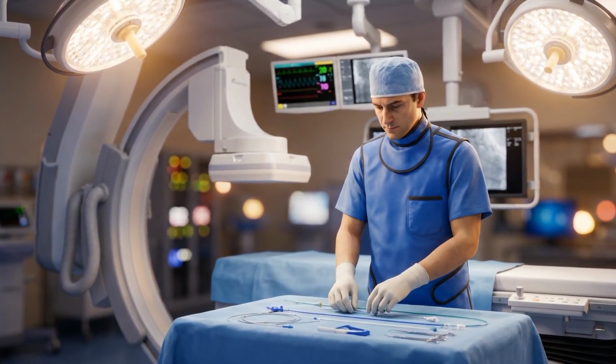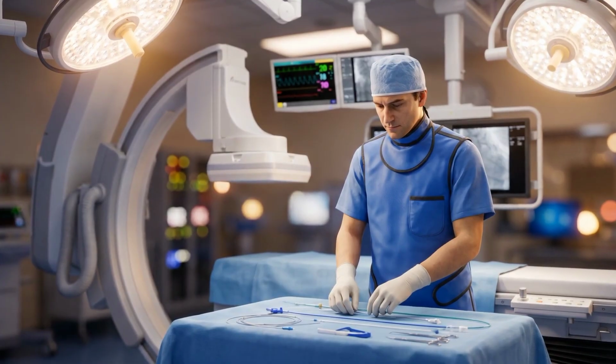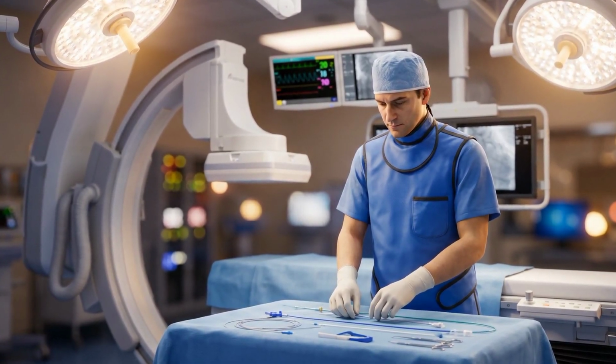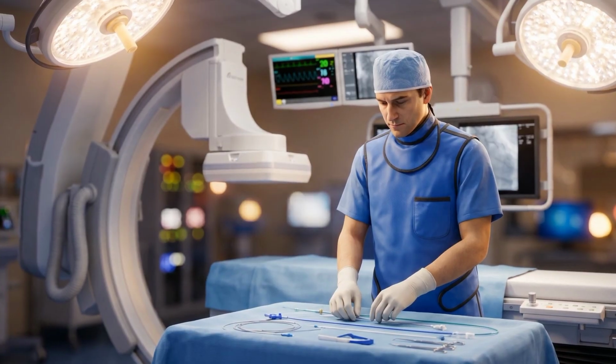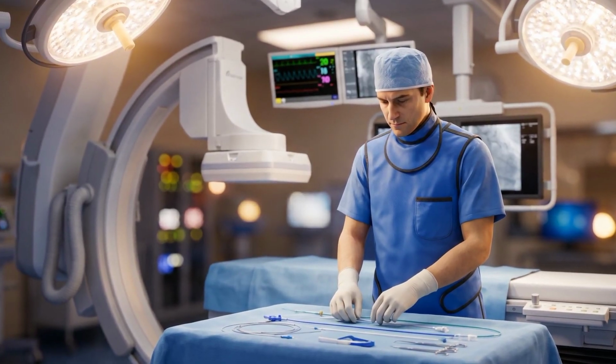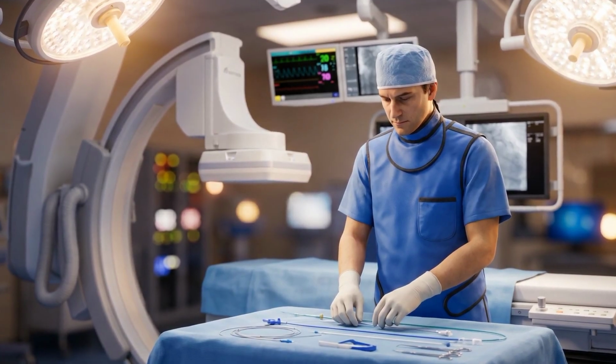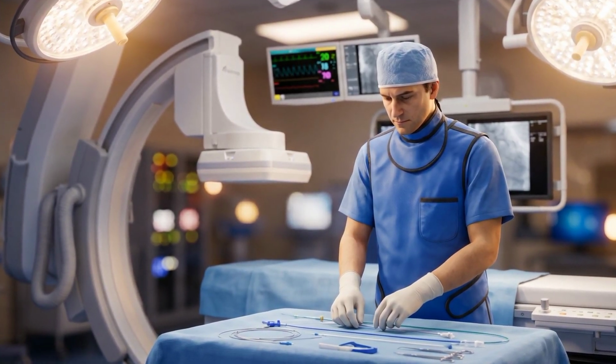Next to it, you will see multiple monitors displaying vital information like ECG, blood pressure and oxygen levels. You can see them there, monitors around the C-arm. This helps doctors to continuously track the patient's condition during the procedure.